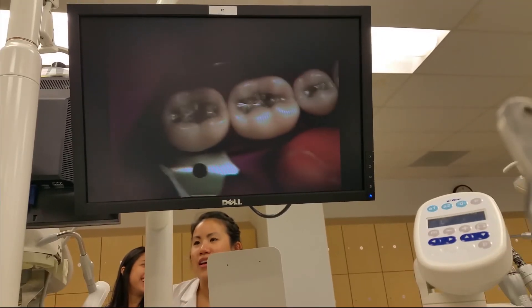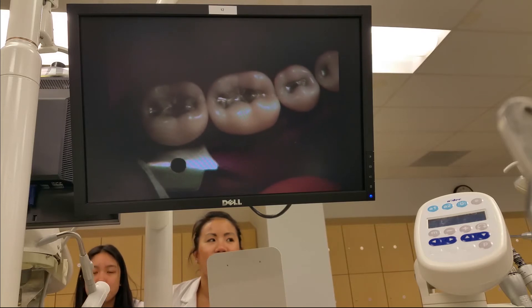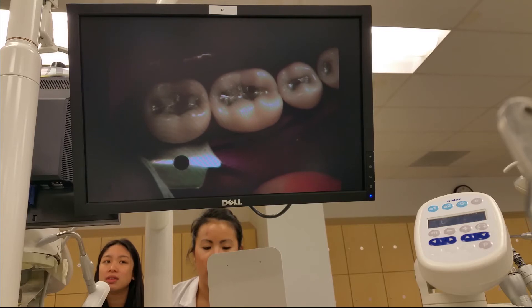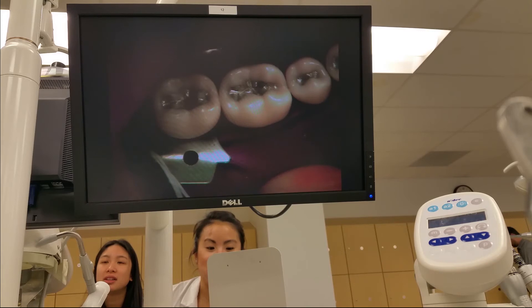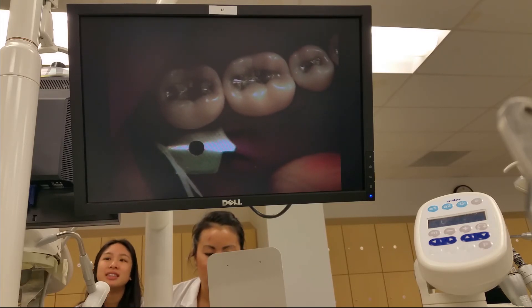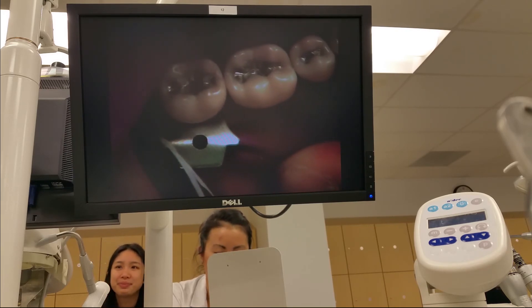The reality is, if you guys just got all the developmental stuff in there and were able to get them polished up like this — now note that some of these are kind of polished, but it hasn't been 24 hours yet. Remember, you're not going to polish for 24 hours, you're going to let it set. But these are beautifully carved, and I think all of you agree this is the kind of dentistry you'd like to see in your mouth. Kudos to you Alexi, and hopefully all of you will approach this during the class or at least during your school career here at Western.